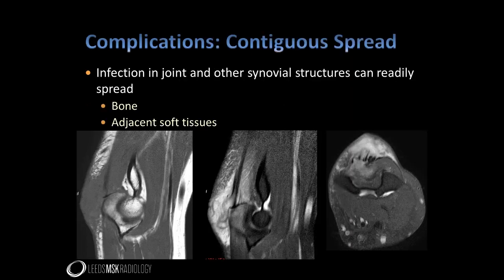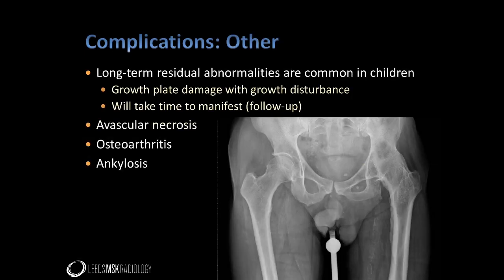Finishing up, we should highlight complications of infection of joints and other synovial structures. The first is that infection may spread from the synovial-lined structure into adjacent structures such as bone. In this case of staphylococcal infection of the olecranon bursa acquired through a penetrating injury, the infection has spread to involve the triceps tendon and bone oedema is seen in the olecranon itself representing early osteomyelitis. Septic arthritis can also lead to long-term joint abnormality and deformity. In children this is particularly true, where there may be damage to the physeal growth plate. Other complications include avascular necrosis and secondary osteoarthritis, and as we've seen, some patients will end up with an ankylosed joint.